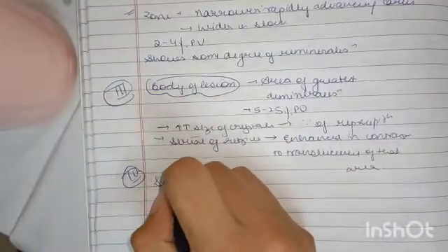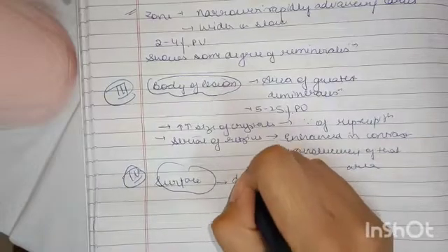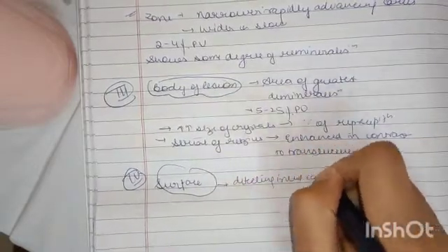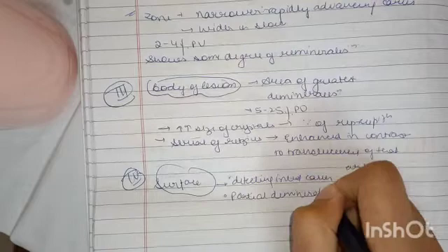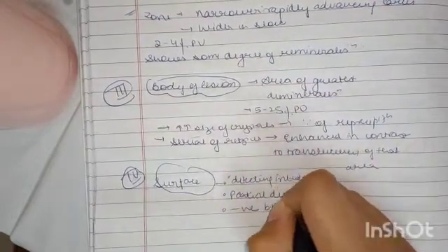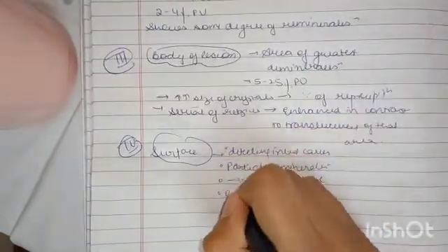Now zone number 4, which is the surface zone. This is a very important feature in detecting initial or early caries. Here you will see partial demineralization. This is also negative birefringence. It also appears to be unaffected.